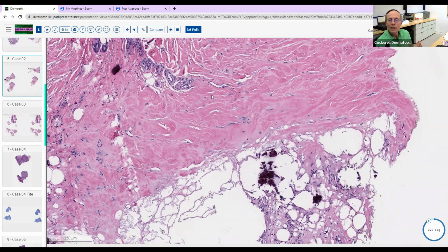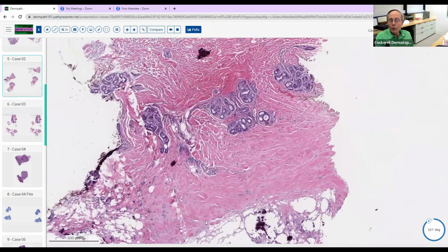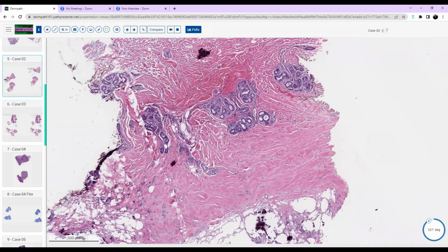So let's just forget about this for a minute, and let's talk about things that give you this sclerotic collagen in the lower part of the dermis here. What are some diseases that can do that? Morphea is one. Morphea and the diseases in scleroderma, that whole family, progressive systemic sclerosis, mixed connective tissue disease, those conditions, and then overlap conditions of those, right? Where let's say you have scleroderma and dermatomyositis together, maybe scleroderma or morphea and lupus together. So maybe an overlap between the two.